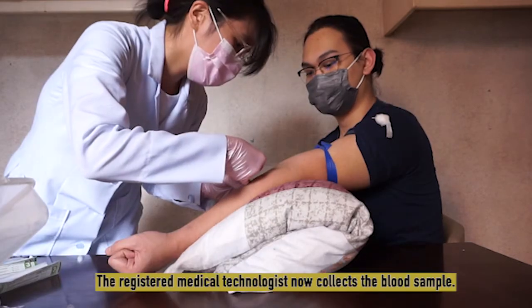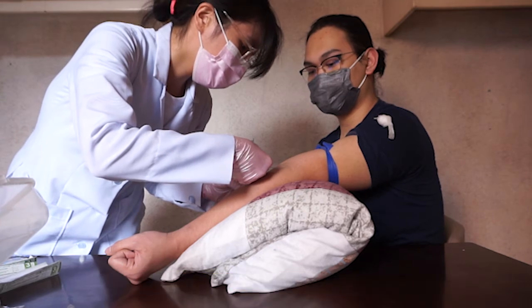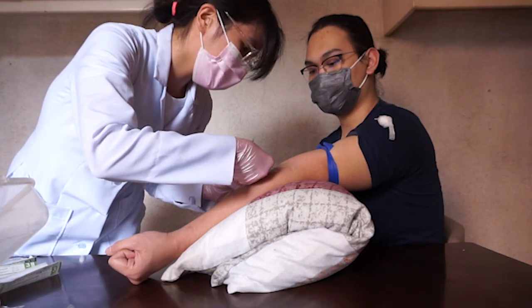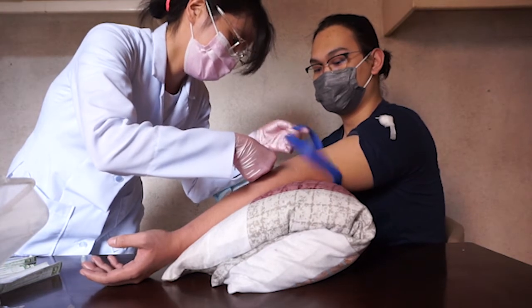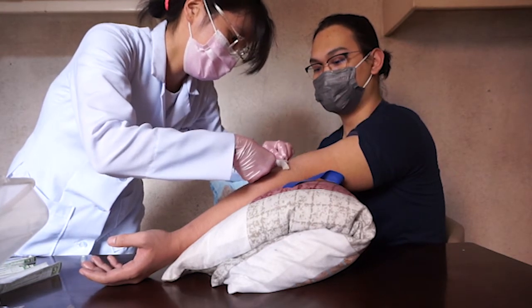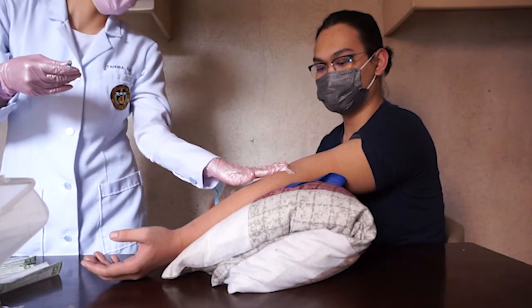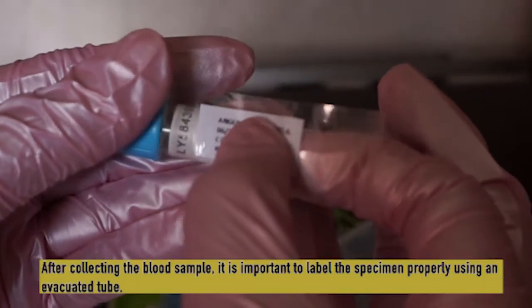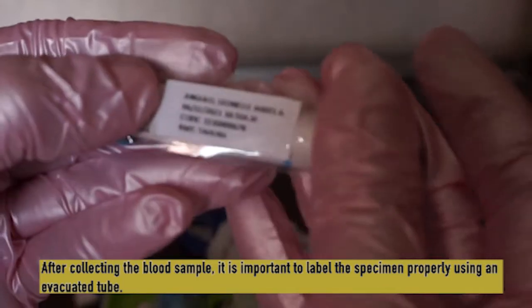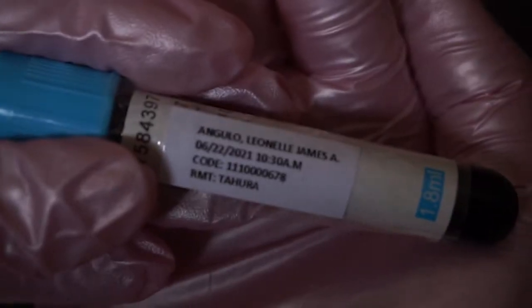The registered medical technologist now collects the blood sample. After collecting the blood sample, it is important to label the specimen properly using an evacuated tube.